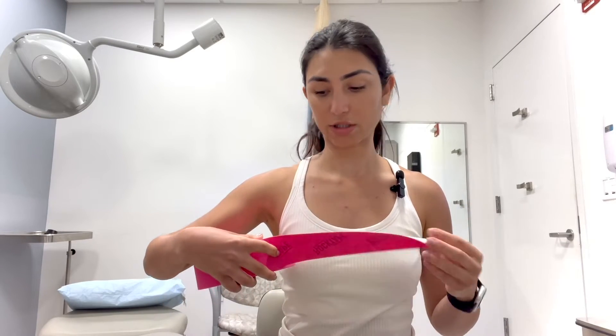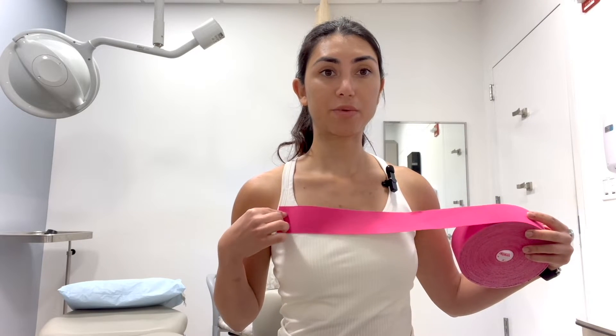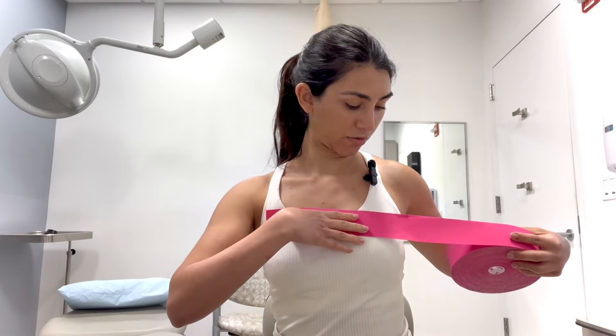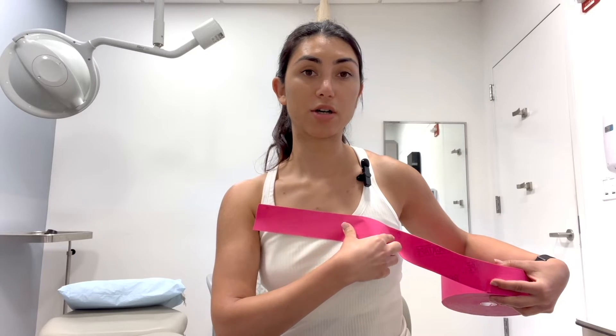We're going to go ahead and measure the length that we'll need. We're going to cut two pieces. One is going to bring the fluid from the affected breast to the healthy lymph nodes across the chest and the opposite armpit. The other one will bring the fluid from the affected breast into the healthy lymph nodes down in the groin on the same side. To measure the chest piece, we start at the unaffected side, place the tape right in front of the armpit where the bra straps usually are, and bring it right across to wherever your swelling ends — that's where we'll cut our first tape.